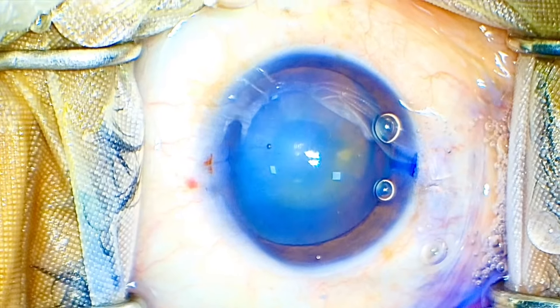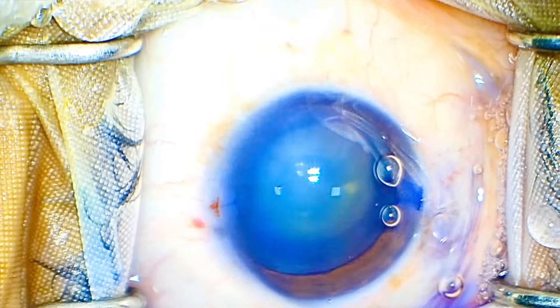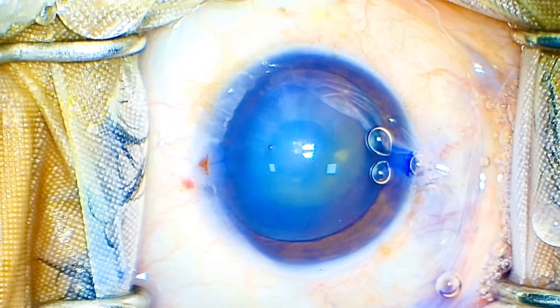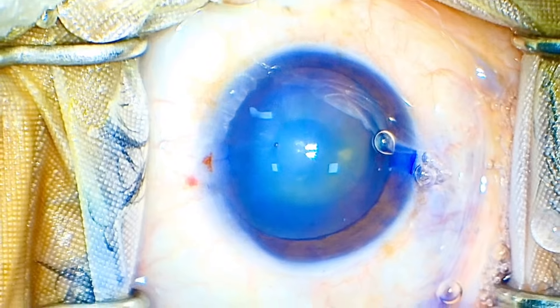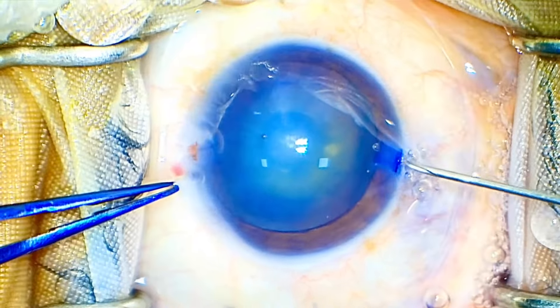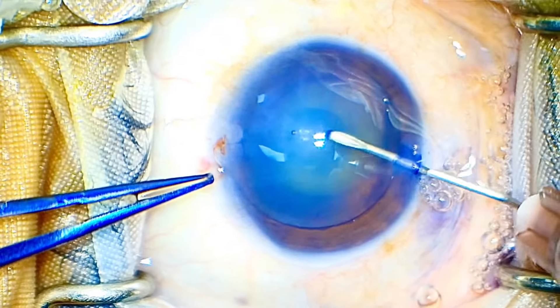I filled the entire chamber with a lot of viscoelastic in the hope of making a good, decent-sized rhexis. The side ports are adequate — they are 180 degrees apart. The capsule has stained beautifully with trypan blue dye. I have made a good cystitome — an obtuse-angled cystitome — and I am going to introduce it into the anterior chamber.